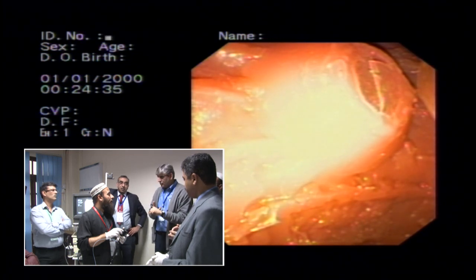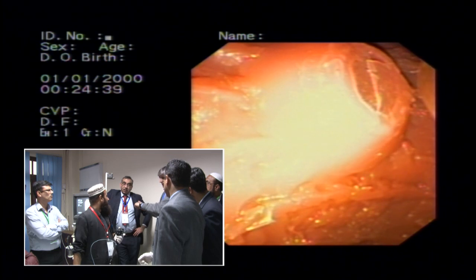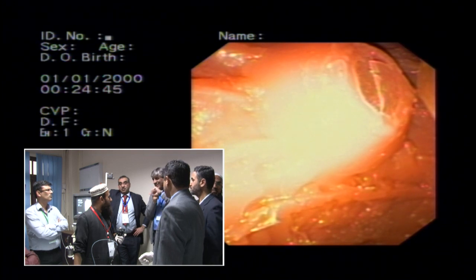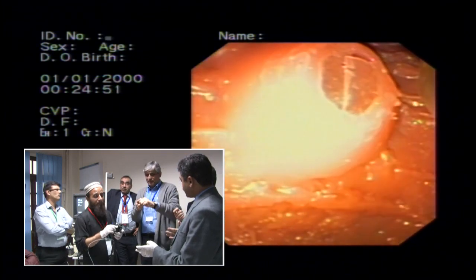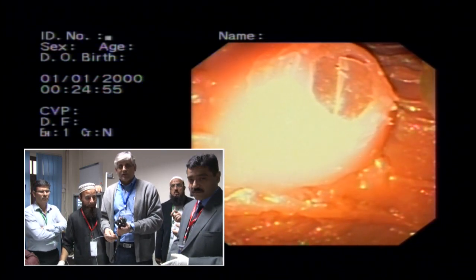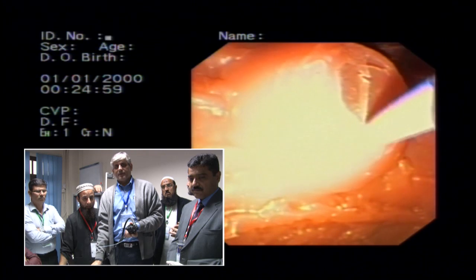What I generally do is I don't advance, and I know he does the same thing, I'm sure. You bring the ampulla close to you. That does the trick, 9 out of 10 times. You don't advance the cannula in. Advance karenge to woh it will get stuck. Yaar woh jab real life mein karenge to zyada ho jayega. Ye aapne engage kare, haan, engage karke thoda sa kheenche, and that does the trick.